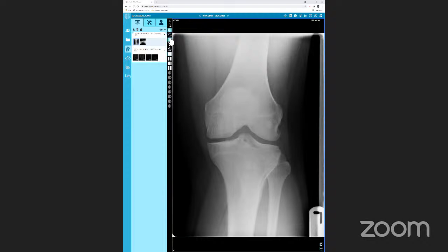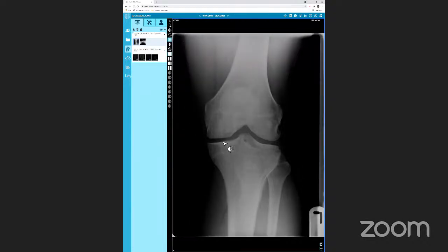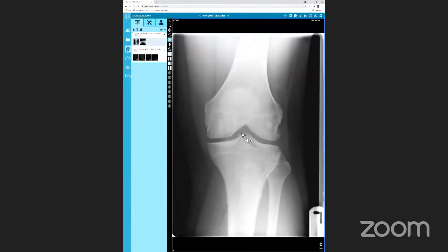I'm not aware of the patient's age yet, and I'm not sure if it's a male or a female. The most obvious abnormality that I can see is projected over the proximal tibial metaphysis. There's an area of ill-defined sclerosis centrally and more to the left. And I think there's some extension periosteally on that lateral cortex of the tibia.